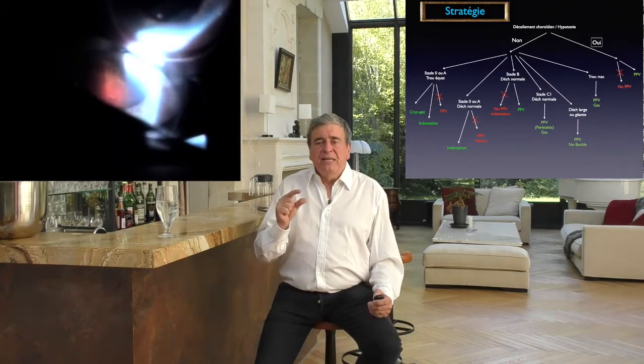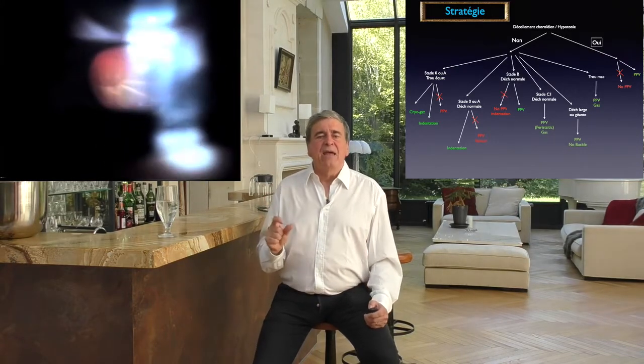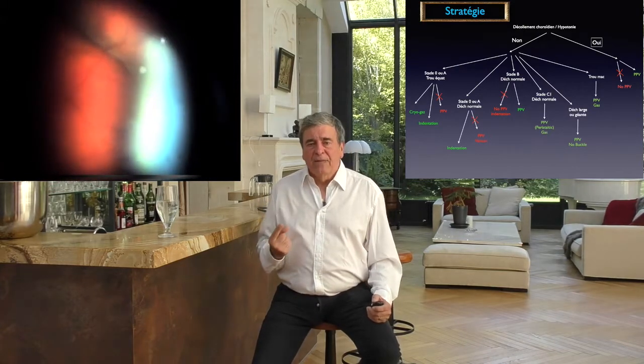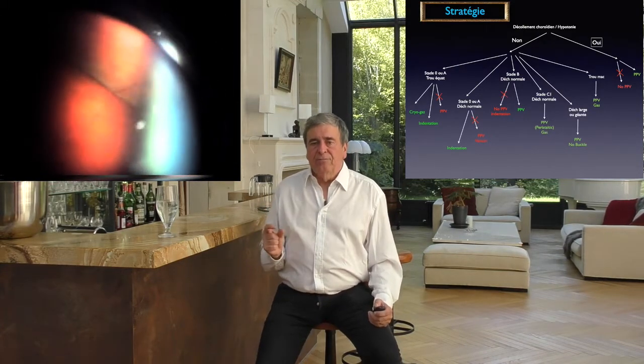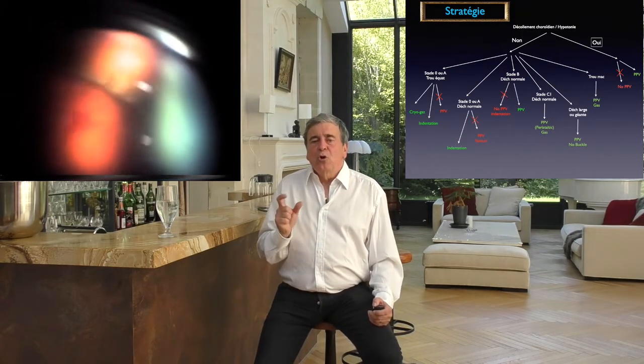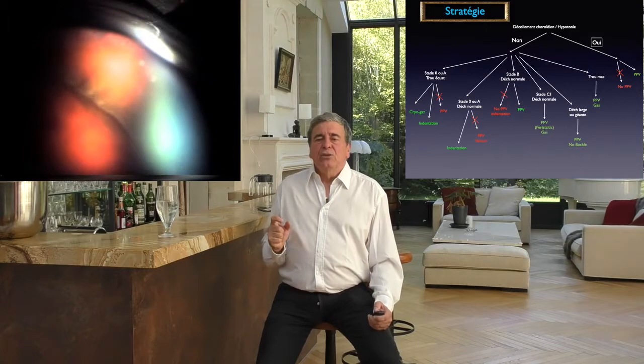The knot being far enough away from the tear will not lift the edge of the tear, and the fold factor of the indentation will treat the retinal shortening due to the retraction. If this does not work, you can always perform a vitrectomy dissection in a second step.